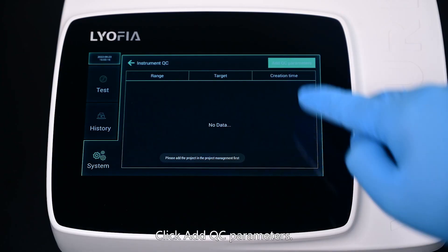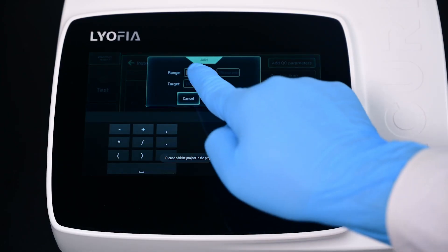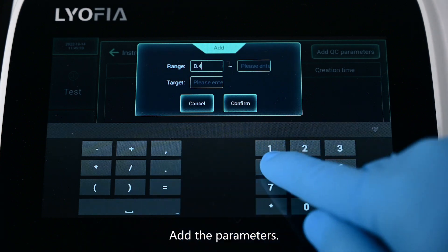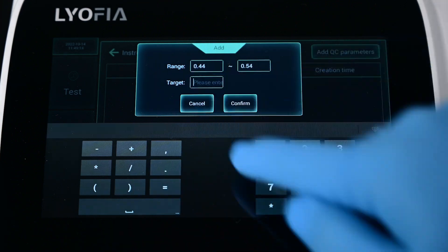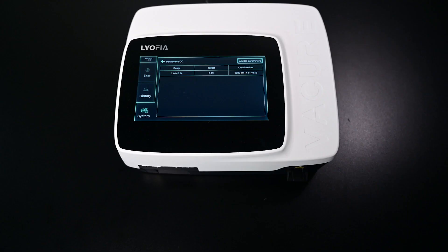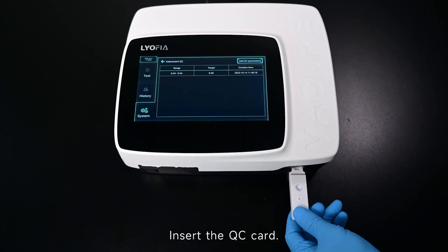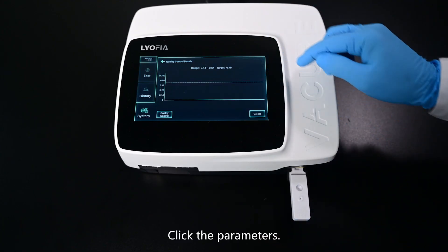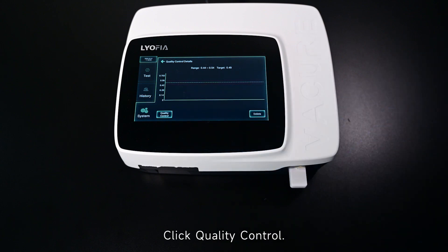Click Add QC Parameters and add the parameters. Click Confirm. Insert the QC card, click the parameters, then click Quality Control.